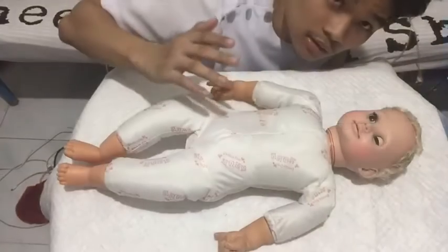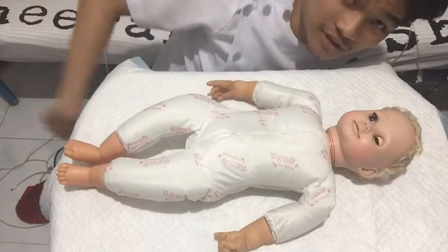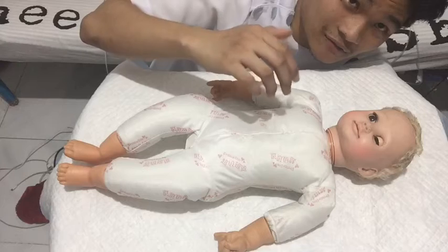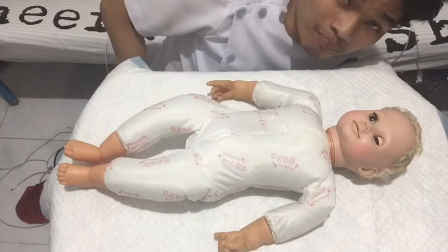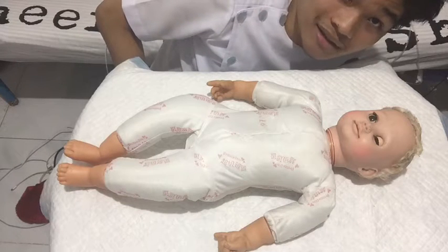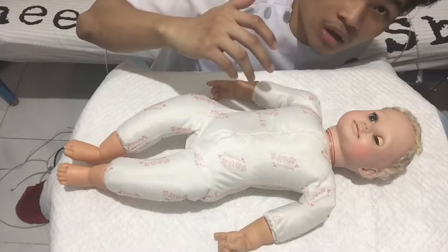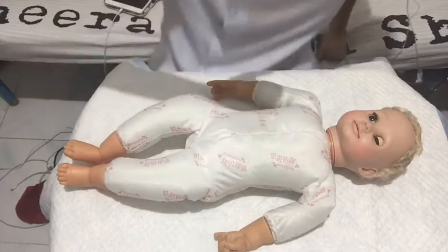Before starting the suctioning, we're going to have to assess the need for suctioning. First, we're going to assess the respiratory status. Next, we're going to see if there are chances of hypoxia. Next, we're going to assess if the baby can clear their own secretions adequately. And next, we're going to assess the chances of low oxygenation, or if the baby may have a hard time breathing.